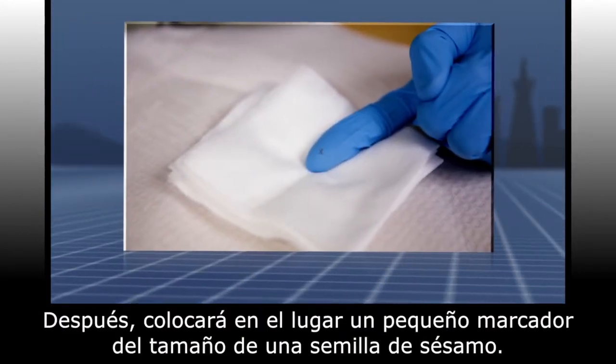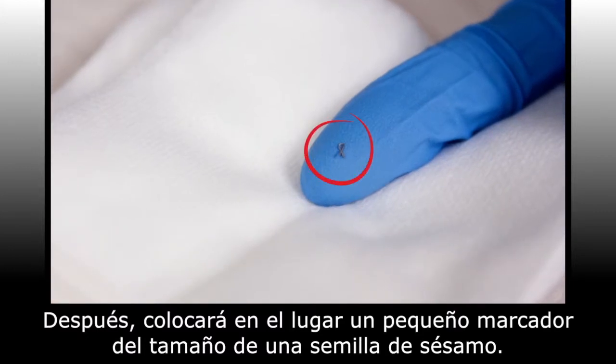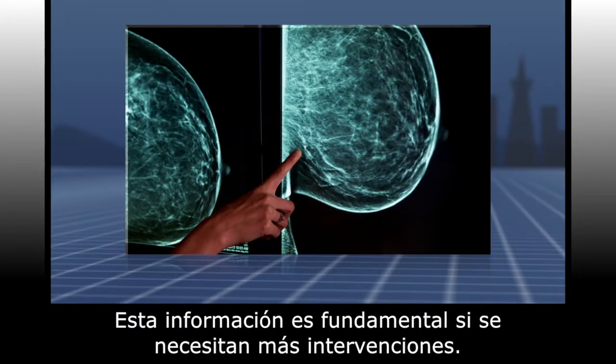The doctor will place a tiny marker the size of a sesame seed at the site. This marker is very important as it marks the location of the biopsy — information that is required if any further intervention is needed.